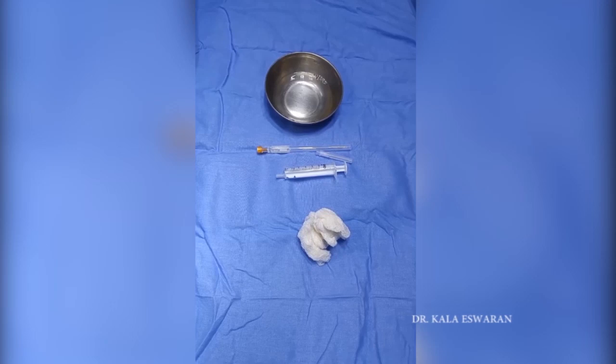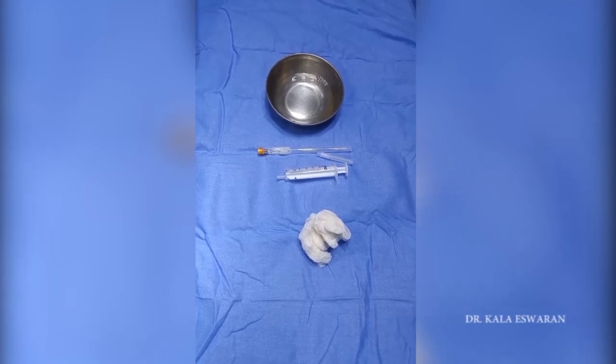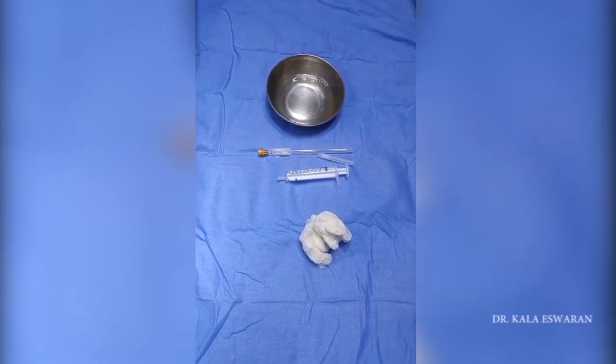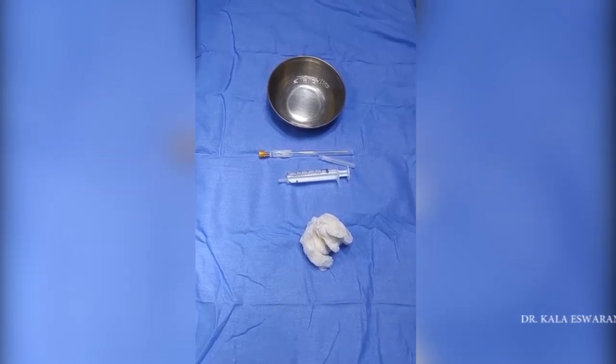For the paravertebral block, I used a 25-gauge spinal needle and a 5 cc syringe.